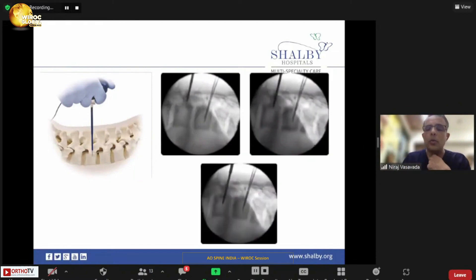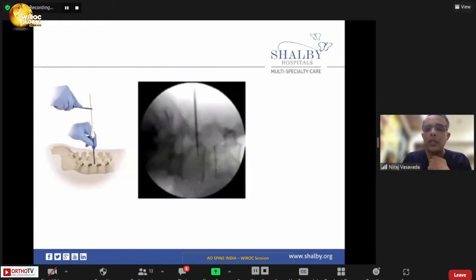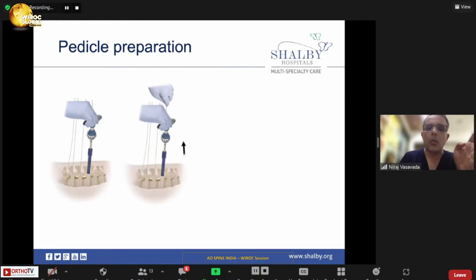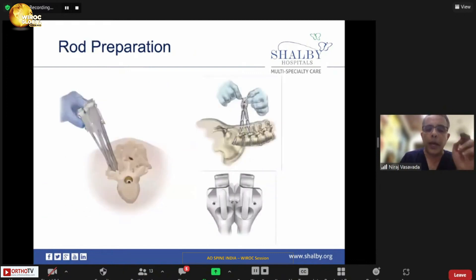Once all wires are inserted, start tapping the screw. Only tap the pedicle — never try to tap the cancellous bone into the vertebral body. Once tapping is done, start putting the screw inside. Always make sure your screw enters the anterior one-third of the vertebral body. Don't go too anterior unless you want a bicortical purchase.